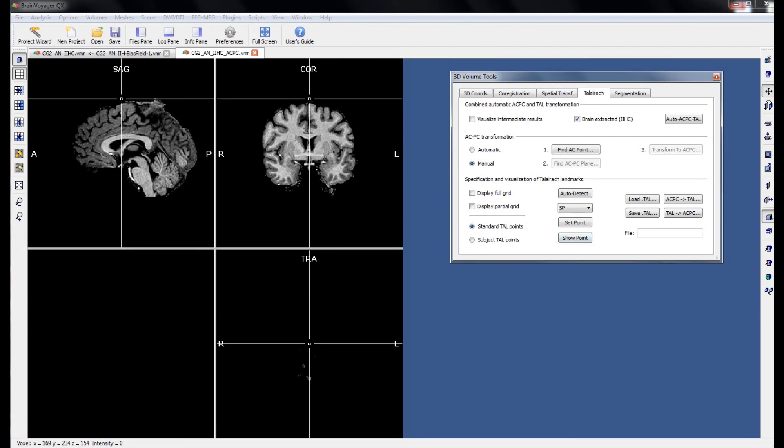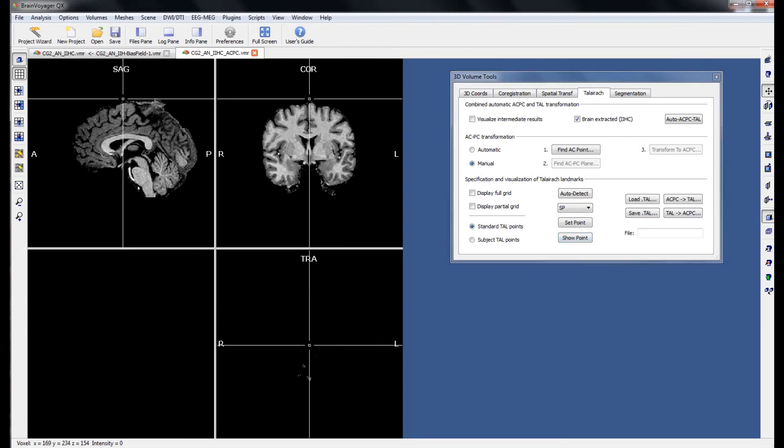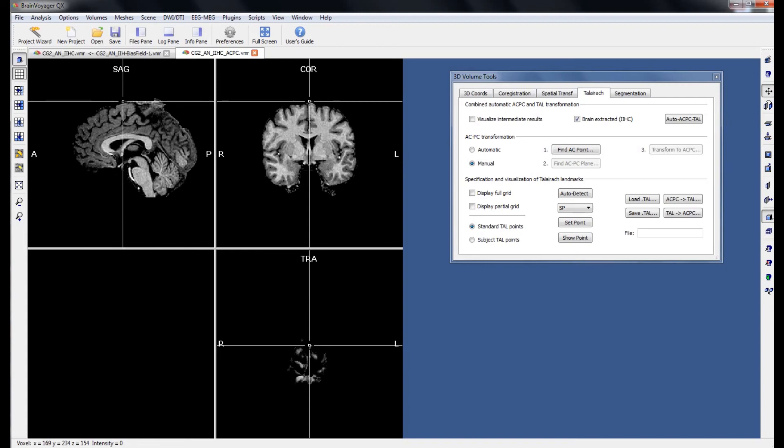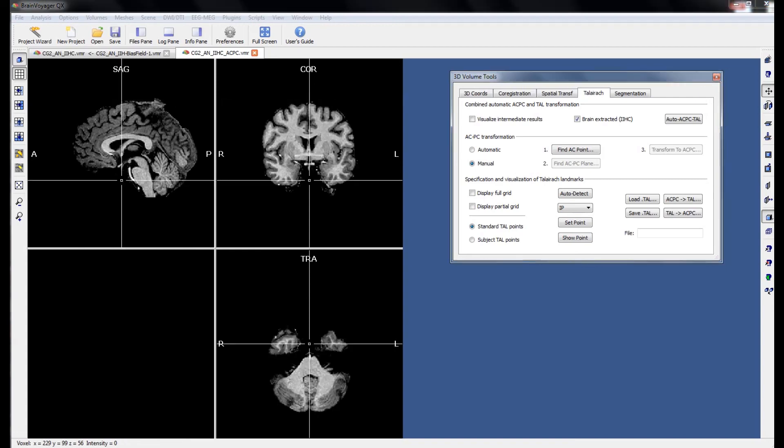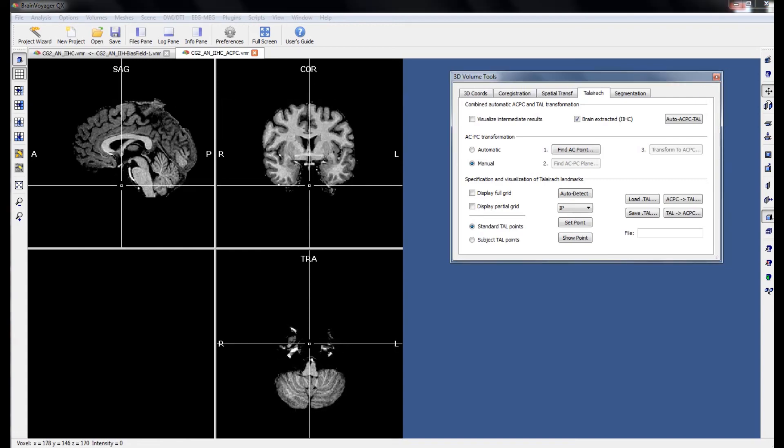The next two points are the superior and inferior points. The inferior point being the most difficult to identify due to parts of the brain that skull strip and fail to remove.